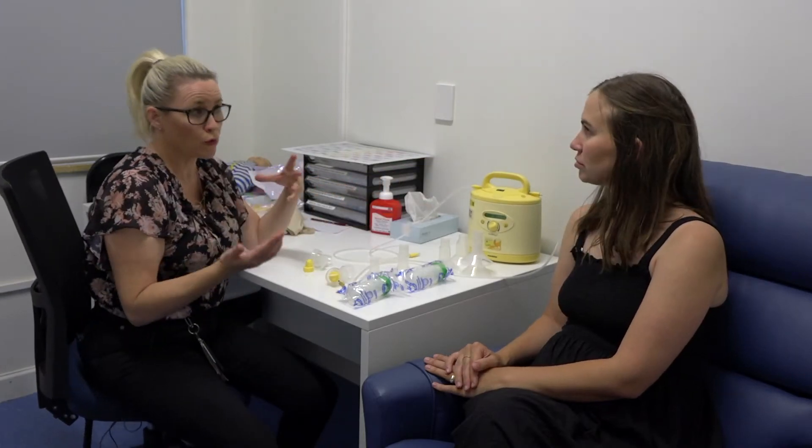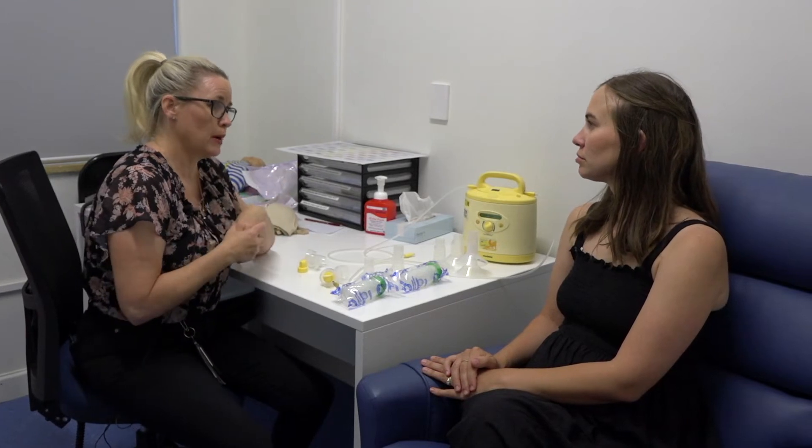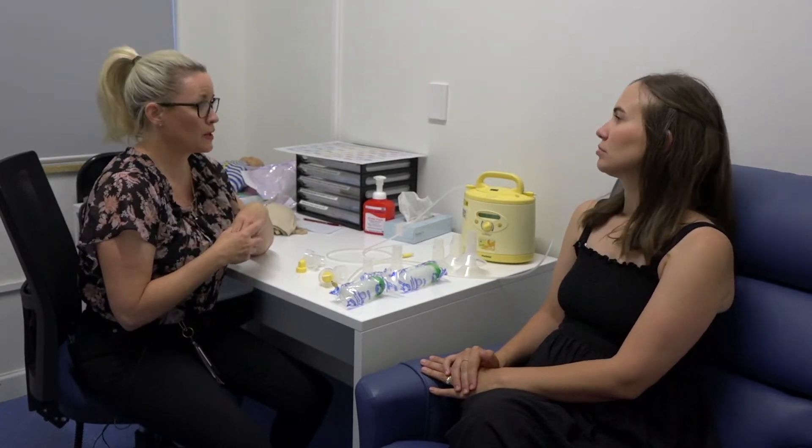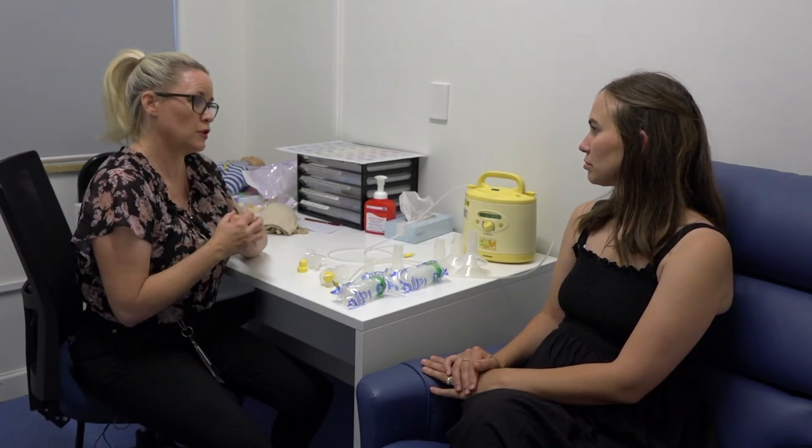If you're having to pump regularly or you're trying to get your breasts to make more milk, we would get you to pump both breasts at the same time, because it's a much more efficient way to pump and much more effective in terms of building milk supply.